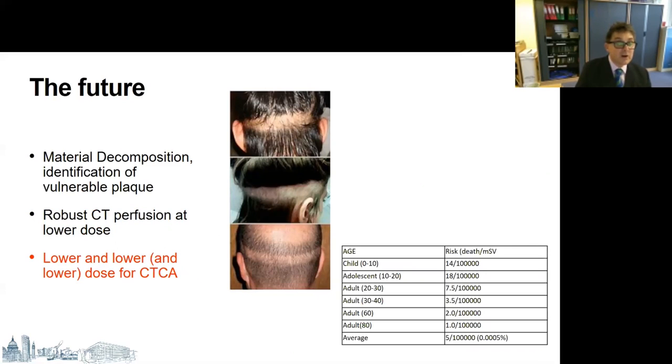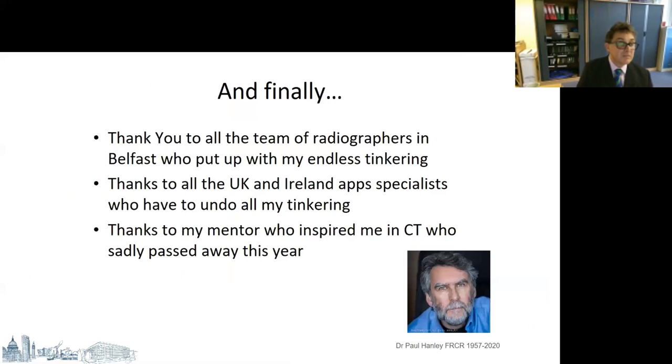The dose of cardiac CT is getting lower and lower. The days of getting the above appearance are thankfully becoming a thing of the past. Bespoking the patient imaging and taking into account the other risk factors, such as age, calcium burden, and device implantation, should all be considered.